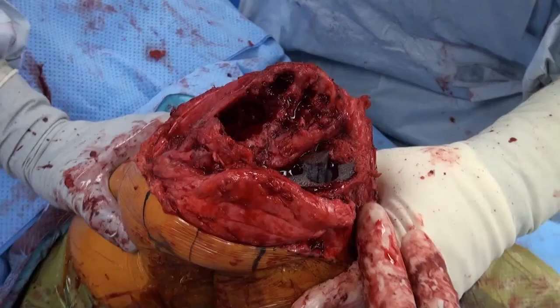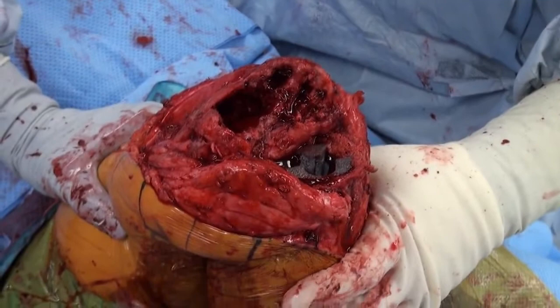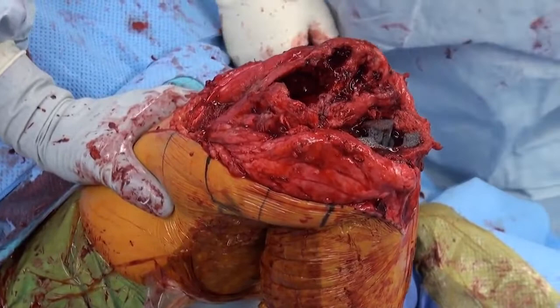This patient has a large cavitary defect of the distal femur due to a prior infected arthroplasty, which was removed. The existing defect is sized with trial components provisionally, and a decision is then made on the reconstructive strategy.